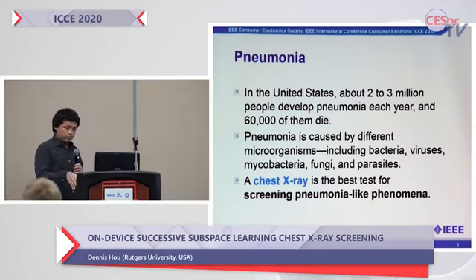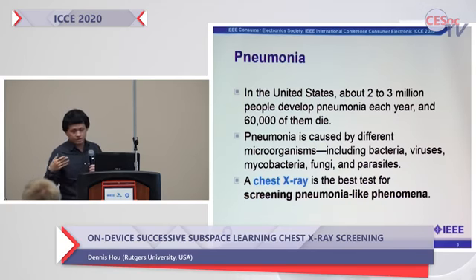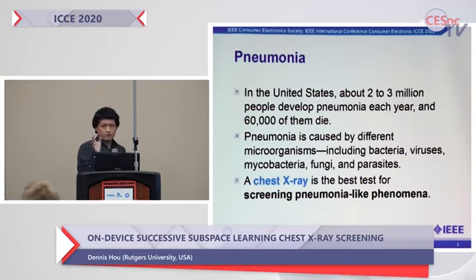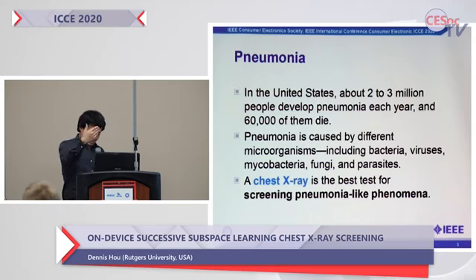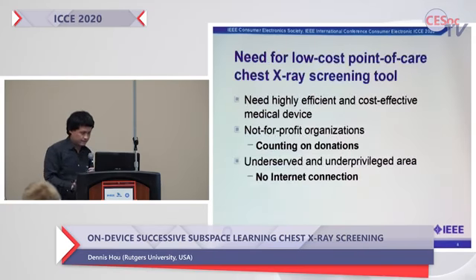And plus you have other diseases that present very similarly, such as Legionnaires or SARS, et cetera. So we're restricting ourselves to basically image classification and detection of what looks like pneumonia, but that's not enough for a diagnosis. So I just want to be clear that this is not a full diagnostic tool in that sense.